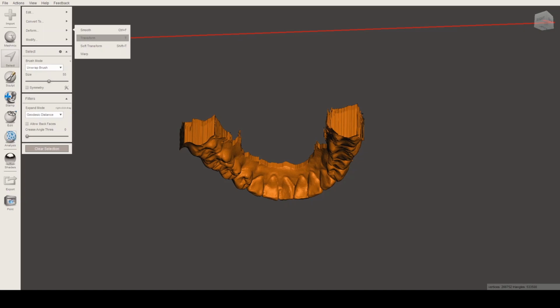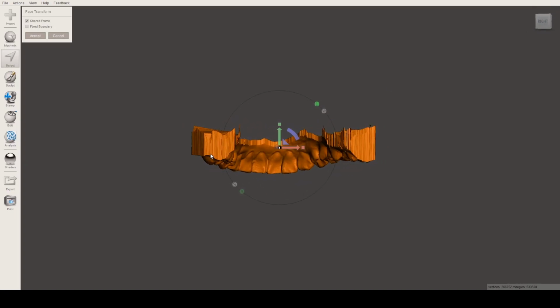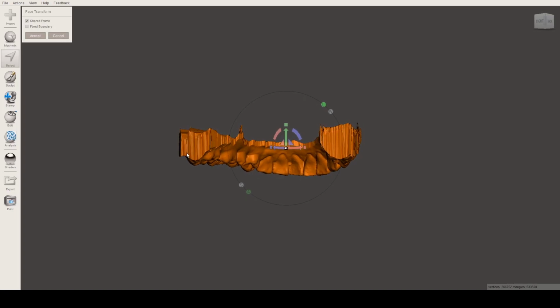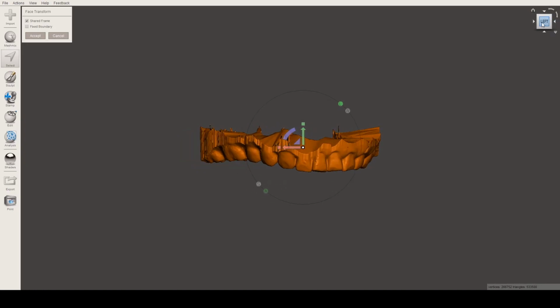Let's try to transform it again. One last time. If it still doesn't work, then we can move on, as long as you know how transform works. I do hope that you have a better computer so you can work with it easily, not like this. It's lagging. Another reason why my computer is lagging right now is because it's recording the screen, and it takes a bunch of computer resources to have that as well. So I'm basically multitasking right now, opening the 3D model and at the same time recording the screen for the tutorial. Okay, let's try that.